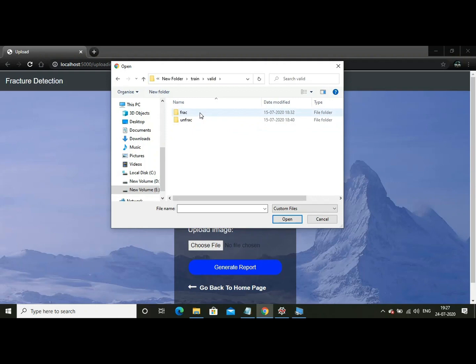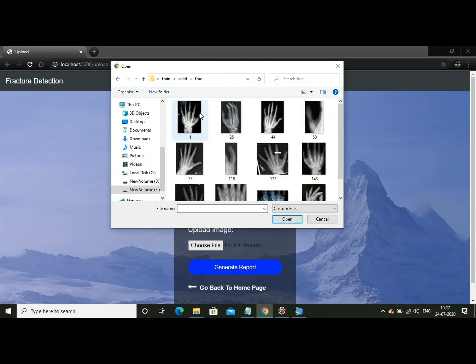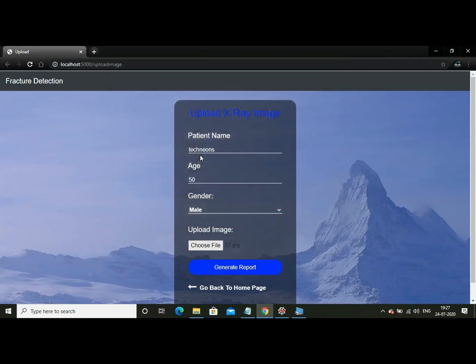Valid. These are the pictures of the fractured images. Now let us take some random image. This one. And you are going to upload it. Now generate report.